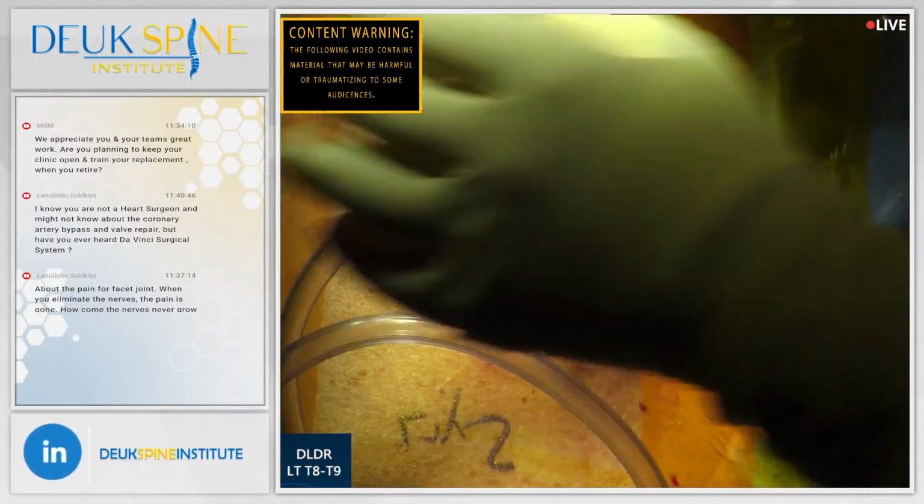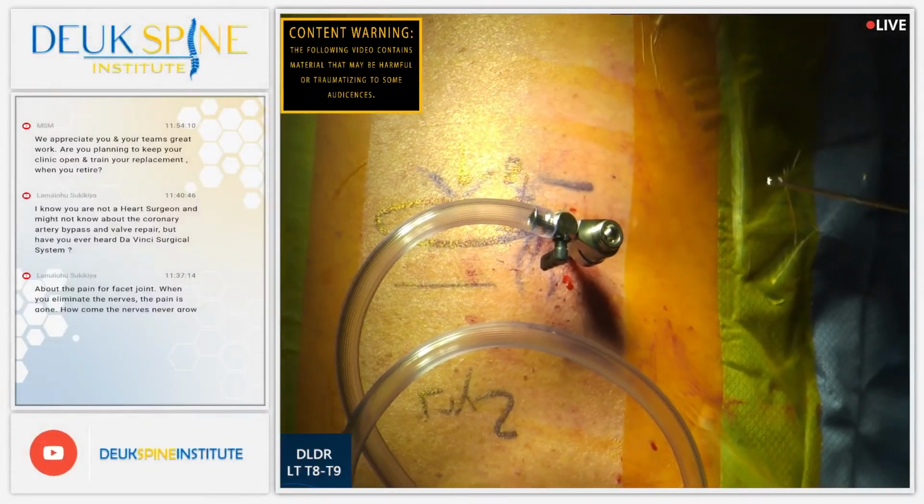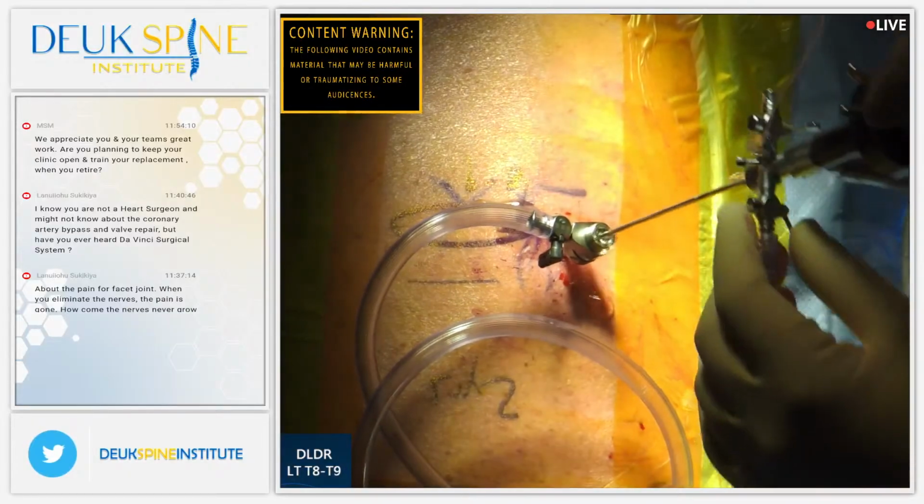Very difficult disc to access, technically, from my standpoint. Was not easy. Probably one of the most difficult I've done, if not the most difficult.